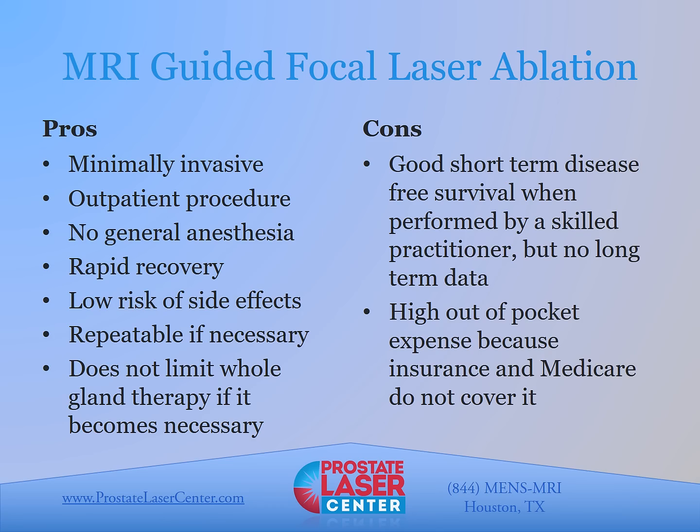It is repeatable if necessary, if residual disease is left, or if down the line a patient develops a new focus of cancer somewhere else in their prostate. And it does not limit whole gland therapy should it become necessary. It's not like radiation. Should a patient need surgery at some point down the line, it doesn't make the surgery any more technically challenging.